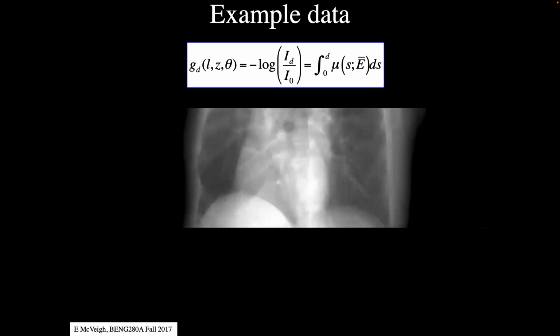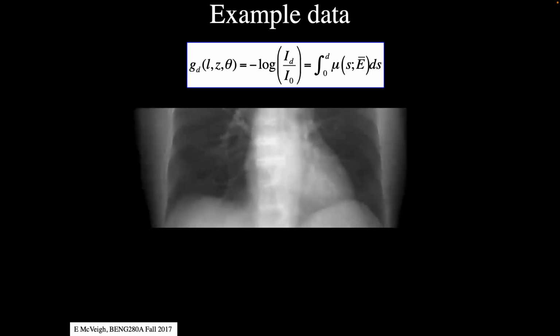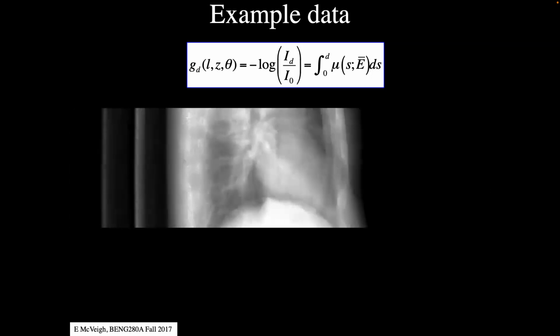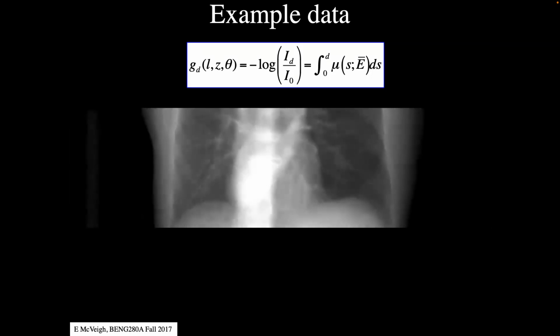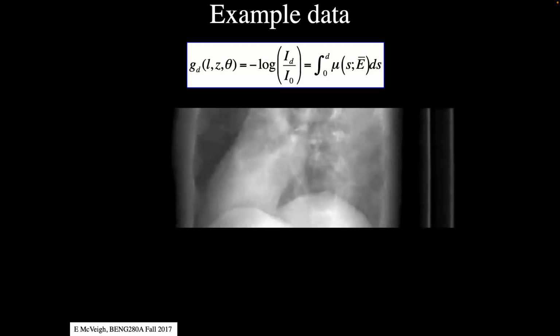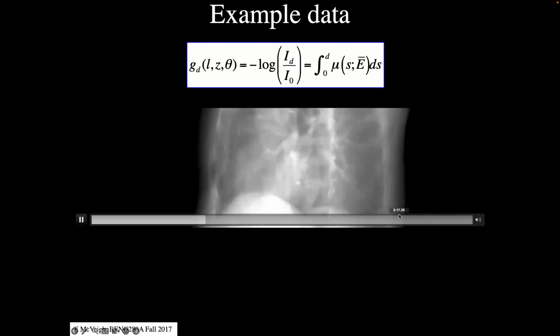Equivalently, you could have a chest X-ray system, and you put the patient on a spinning stand, and you could spin the patient. If they stayed still and all they did was spin, then you could make a CT of that patient, right? Just by spinning the patient. And so that's the theta dimension. And then Z is this dimension.